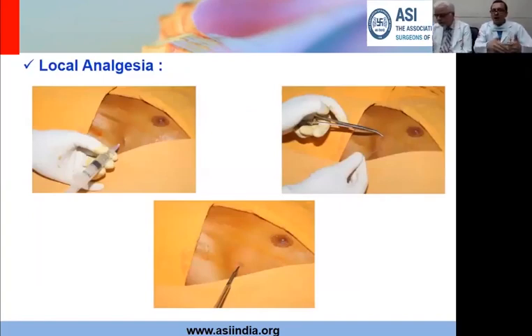Next step comes local analgesia. It's important that you first choose the site. Okay, this is the site in which I'm putting the chest tube. You raise a skin wheal properly, but before you do that, please warn the patient that I'm going to put an injection. You will have pain, but after this, you will have a painless procedure.